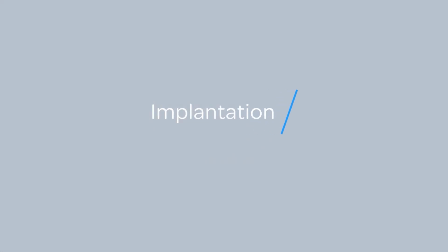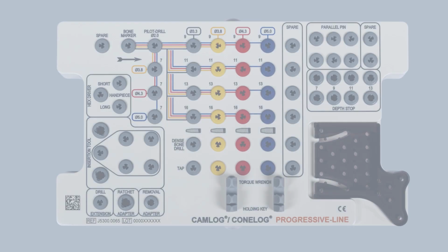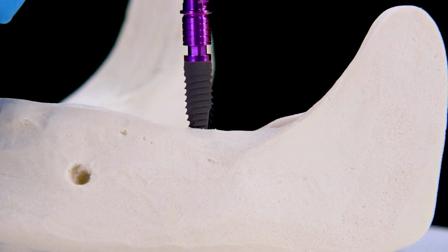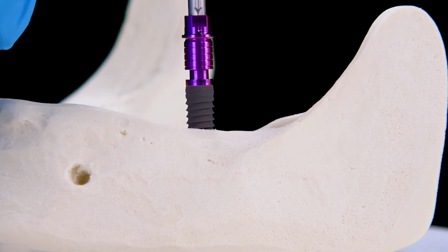All CONELOG progressive-line implants come with a self-tapping thread. The implant is inserted manually or by machine into the coronal section of the implant bed using the insertion tool.